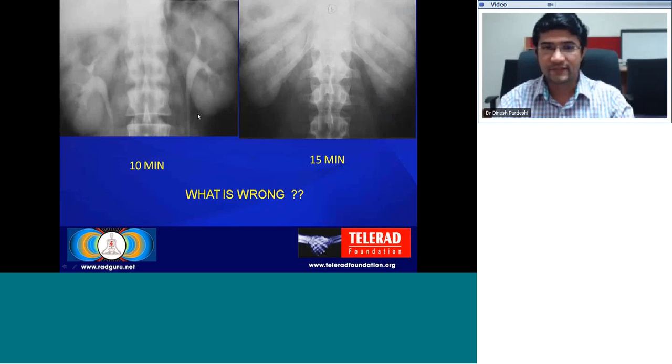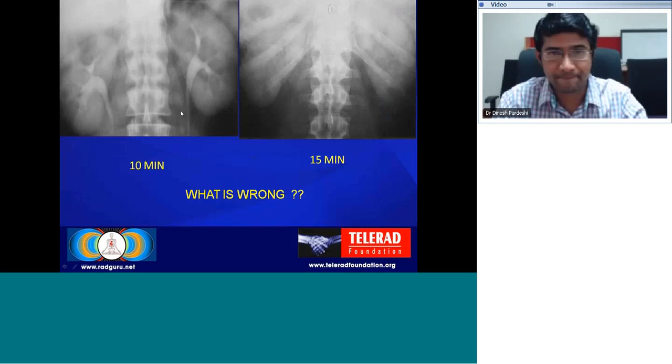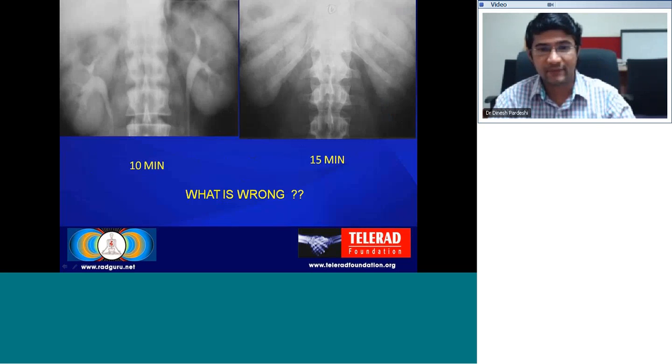Okay, this is the last question here. Here we see the 10 minute film where we see the nephrogram normal, the opacification of the pelvicalyceal system and the ureter normal. But after the next film, on the 15 minute film, what we are seeing is an opacification of the kidneys, there is only nephrogram and the pyelogram is not seen. So what is wrong? Is the timing wrong or what do you think? What is going on here?